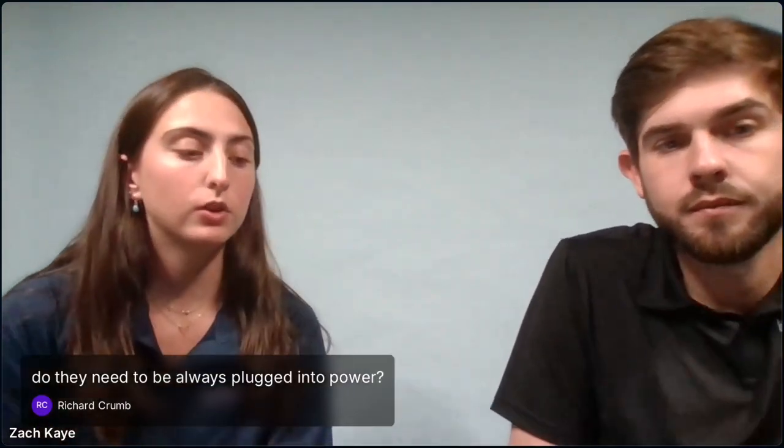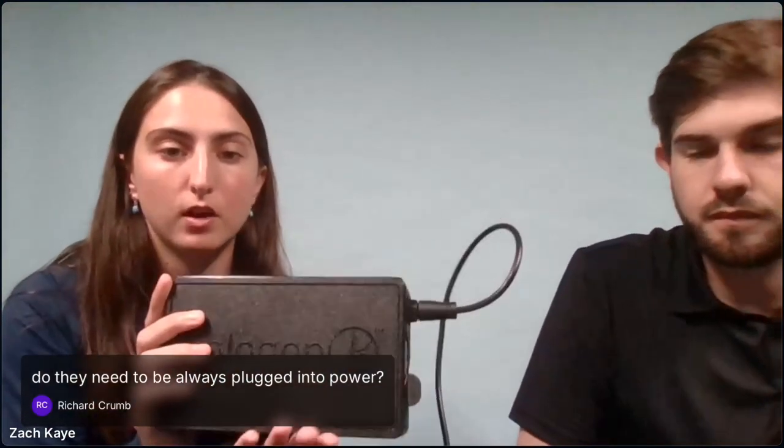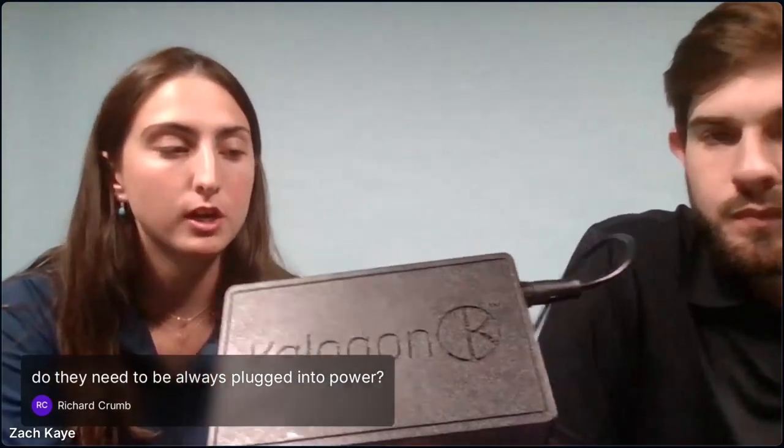And then Bruno, I'll respond to you via email because I know we have spoken recently just about the cushion via email. So I'll go ahead and shoot you another email there and see if we can work out something. So Richard, you said, do they need to always be plugged into power? The cushion always has to be plugged into the control box. This is the brains and the operations behind what's going on in the cushion. Regarding charging this, it's an 18-hour battery life on a 2-hour charge. So it does always have to be plugged into the control box to be operating.